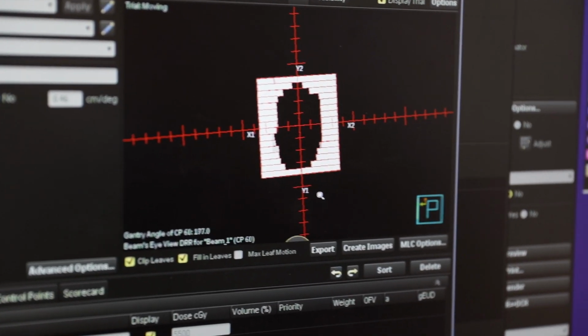In such a situation, where a high dose is delivered in a few fractions, there are much fewer opportunities to correct or adapt the treatment dose. An error in any single fraction would have a larger proportional impact, and therefore the dosimetric accuracy is expected to have a greater effect on radiotherapy outcome. It is therefore essential that such treatments be verified by undertaking appropriate quality assurance, or QA.